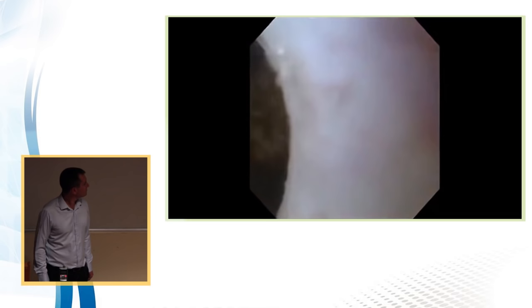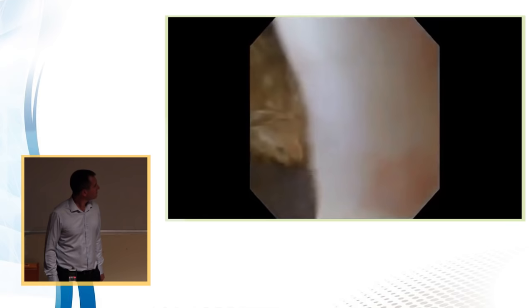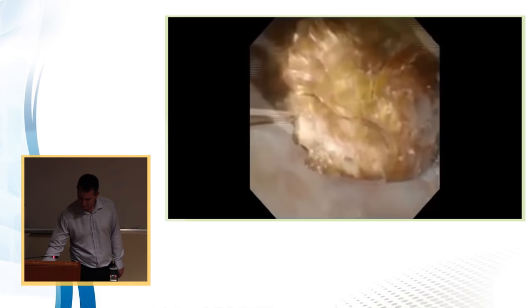There have been studies that show that using 0.2 joules creates fragments smaller than 1 to 2 millimeters. It also helps to preserve the tip of the fiber. So this works really well on softer stones. When you have really hard stones like calcium oxalate monohydrate, it can be harder to dust the stone. And that's when I would consider using a setting to fragment the stone, so I'd get a free-floating fragment, possibly so big.